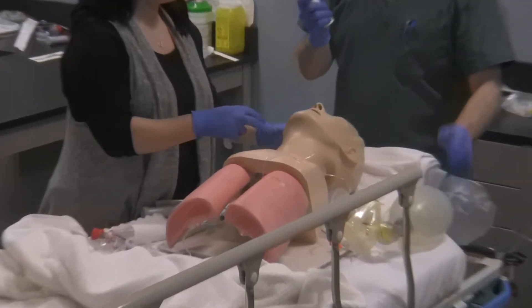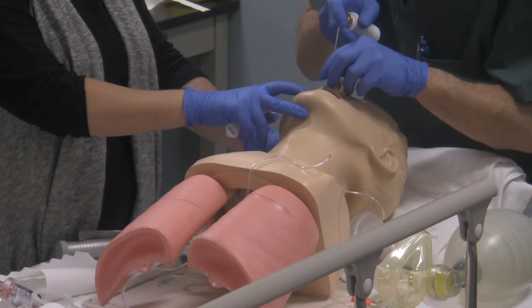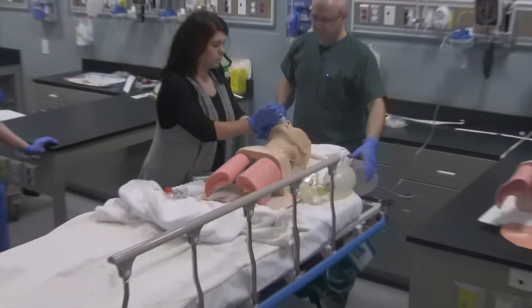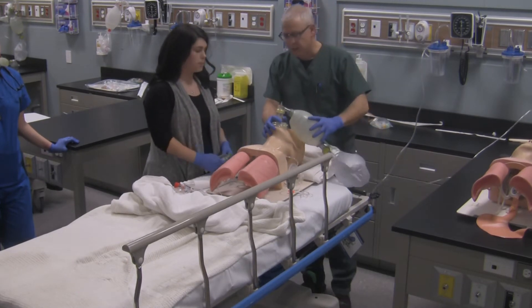Brittany, can you take your open hand? Donald, you're going to feel it going in. Sprays — maximum of ten. After we do that, Donald, I'm going to breathe for you again now.